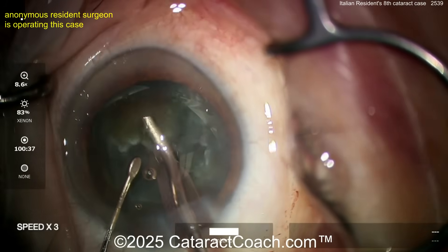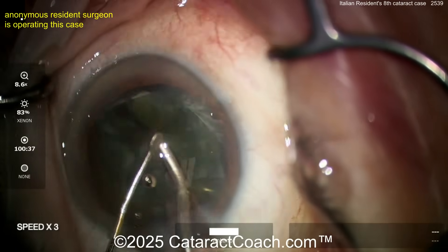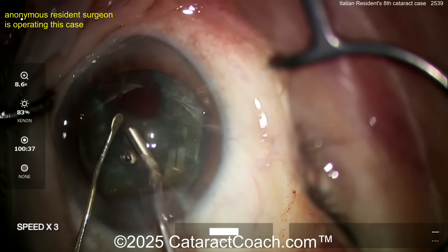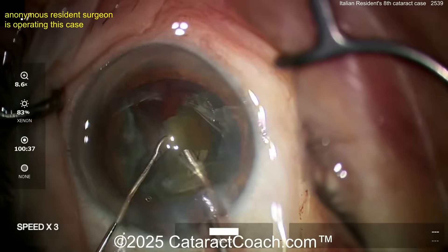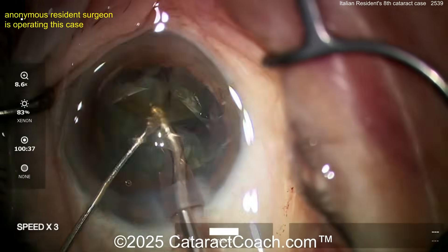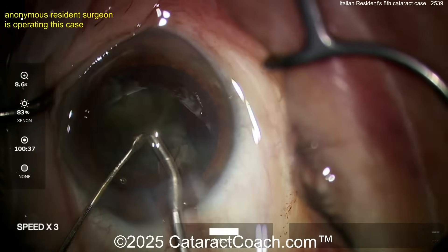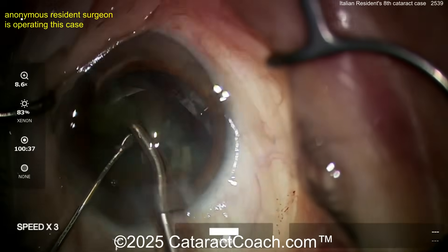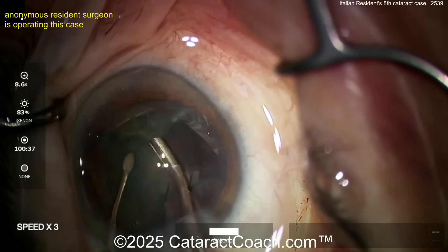That's really, really good. But your goal here is not speed — what I'd rather you do is take five extra minutes and keep the eye in primary the entire case. See how the eye is not in primary? This is how I know you're a beginner. I shouldn't have this eye going out of view. See how the eye is being pushed up against the lid in the nasal cantus? You don't want that. Keep the eye in primary. Part of it is keep your right hand down — the probe should be almost parallel to the iris, and both should be almost parallel to the floor of the room.